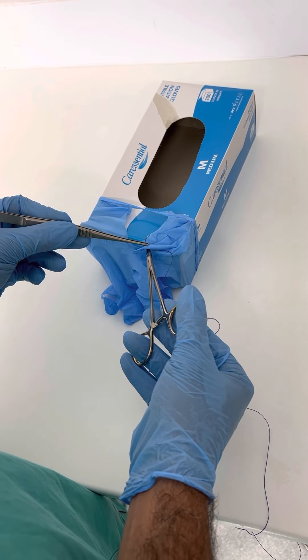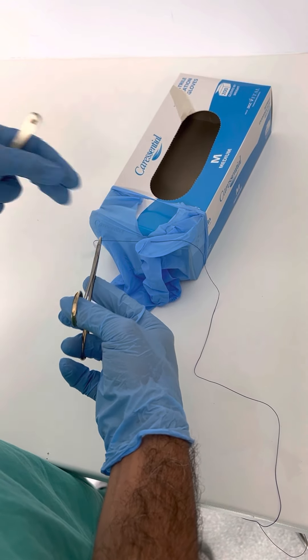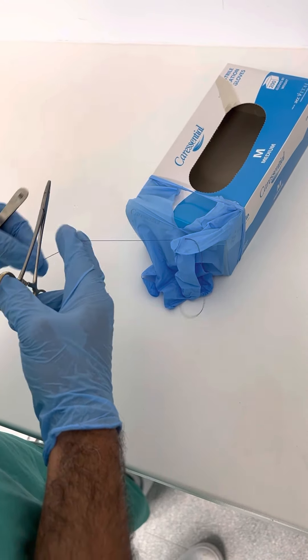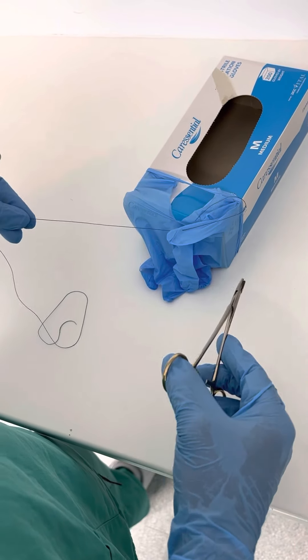I'm just going to grab this and bring it out like that. At this point I'm just going to grab it there and pull it until I've got a reasonably short tail left.